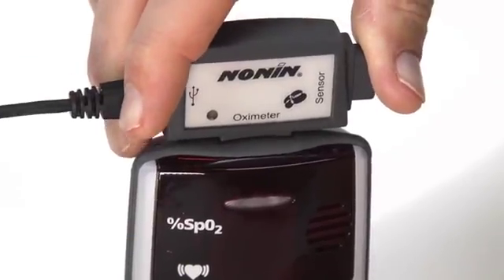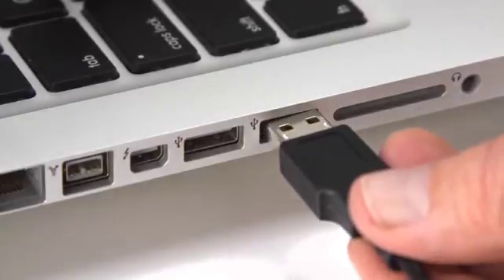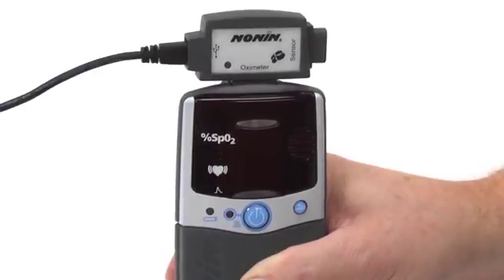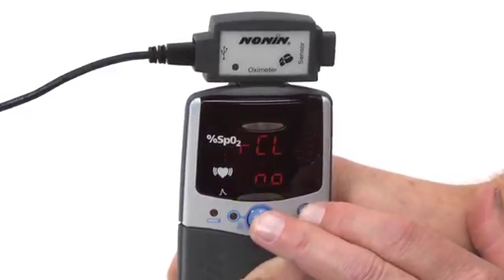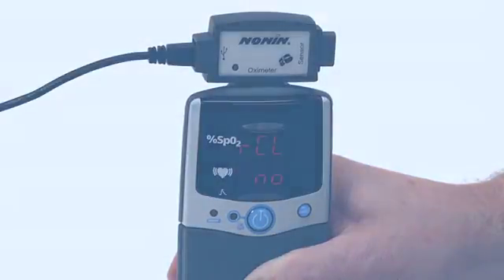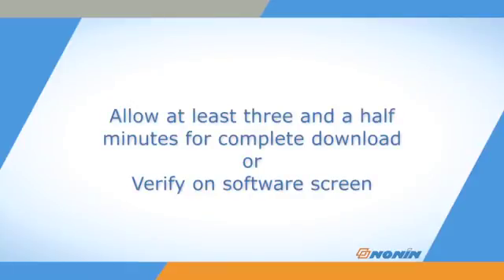To download the 72-hour memory from the oximeter, attach the appropriate cable or data collection drive with the 2500 model turned OFF. Press the ADVANCE and ON-OFF buttons and release only the ON-OFF button, just like entering Setup Mode. When the CLEAR NO icon appears on the 2500 model, or the recall alarm setting NO appears on the 2500A model, the oximeter memory will begin download. Wait for at least three and a half minutes for the data to transfer to the computer or data storage drive.